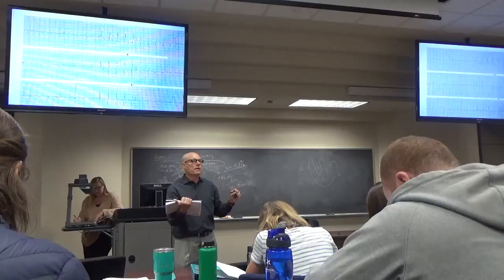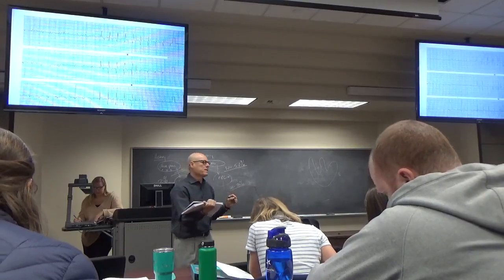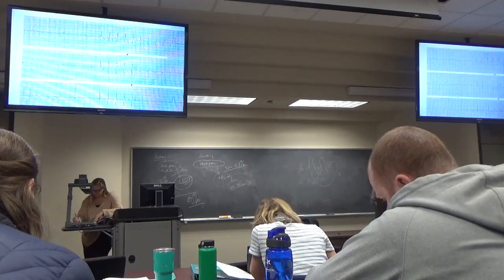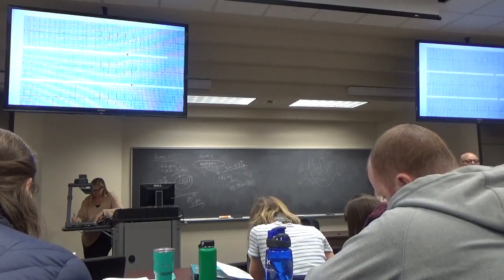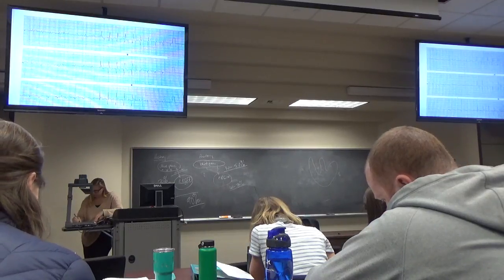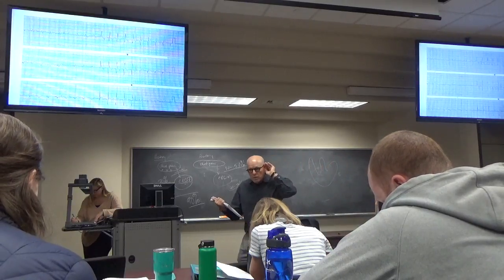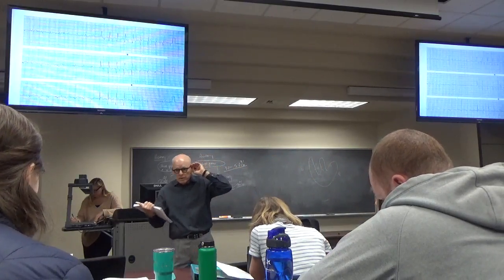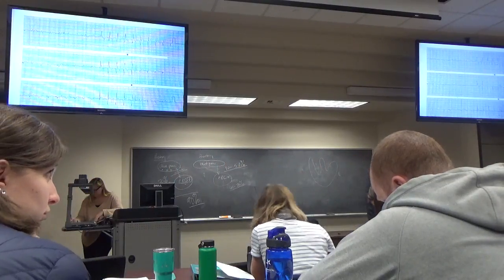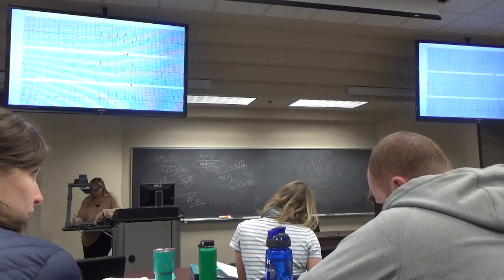Let's go back to the rhythm. Is there a P wave before each QRS? Yes. Are there more than one P wave between each QRS? No. What's the rate? 120. 120? Yeah. 125? Okay. It's greater than 100, so it's tachycardia.